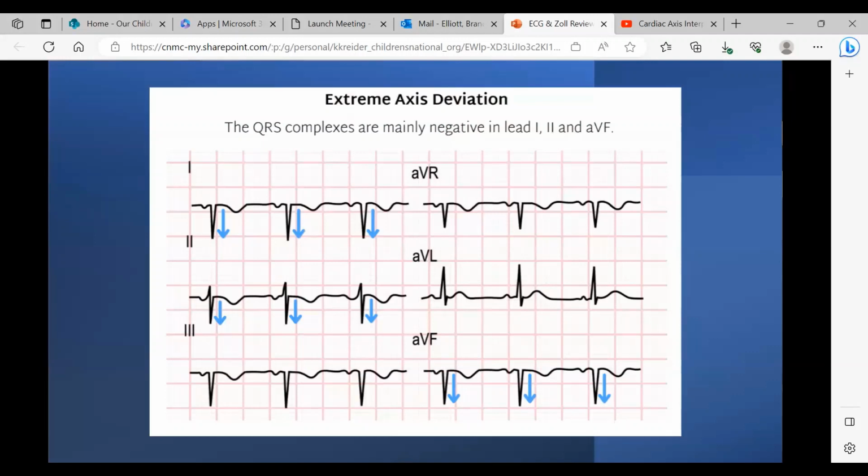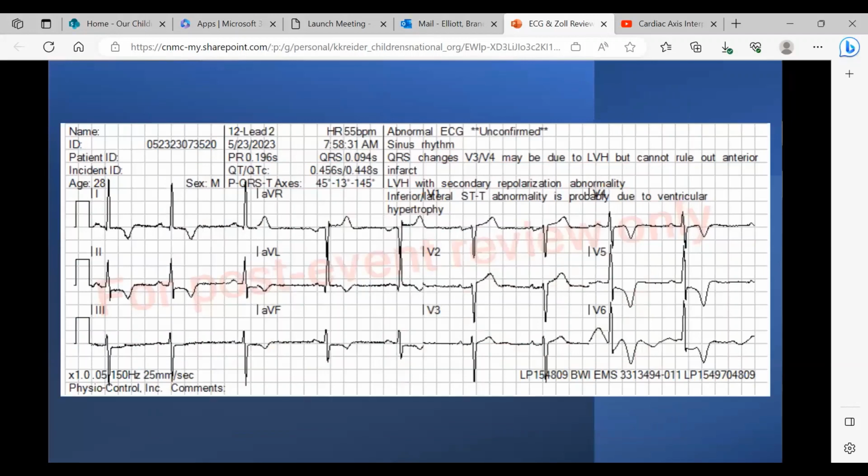I'm going to have my lovely assistant, Josh, do some interpretation for me on this guy right here. So this one we can look at step by step. First thing we talked about was the P wave, the QRS complexes, all this. I'm going to look at those first. So my P waves look normal, so probably a sinus of some sort. All of my QRSs look narrow enough.